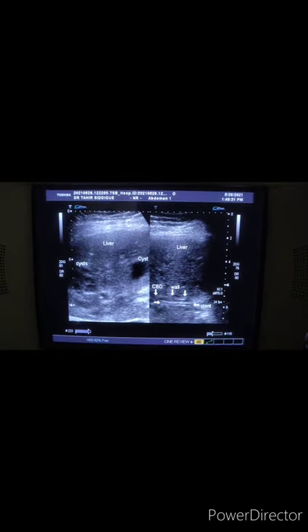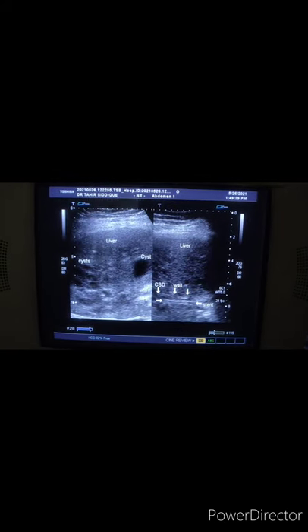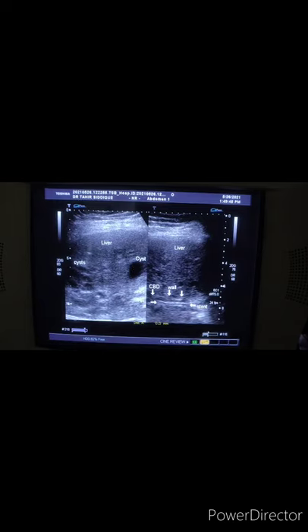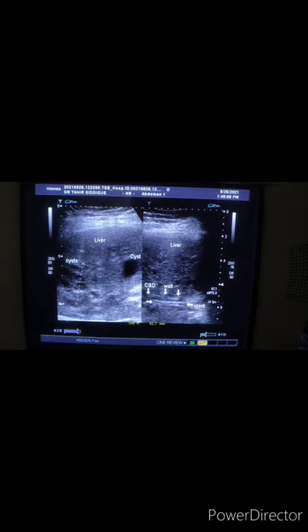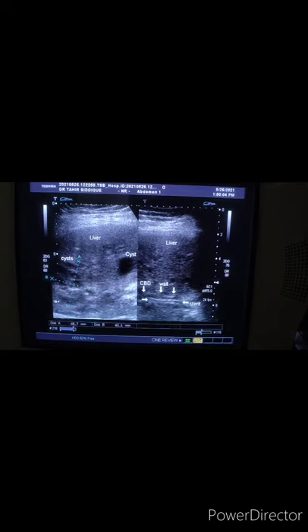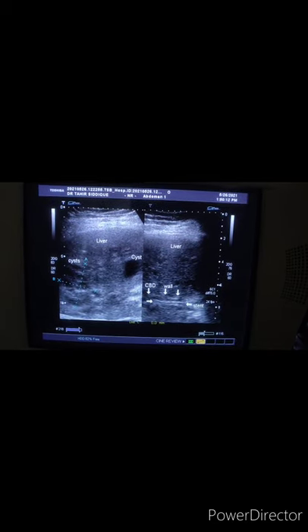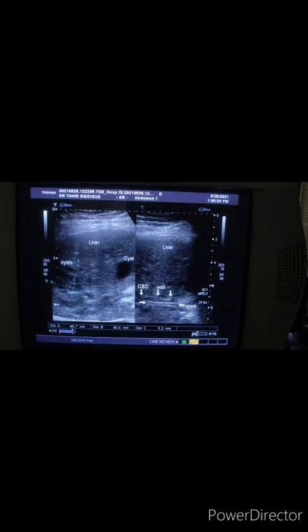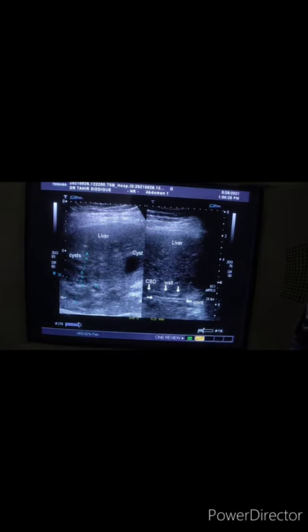On the right side of the screen, there is a cystic area, well-demarcated, internally clear of any calcification. The liver is just fatty. This is an area with multiple non-communicating cysts of variable size — counting 1, 2, 3, 4, 5, 6, and a 7th — not too big. The largest measures approximately 9.3 mm.